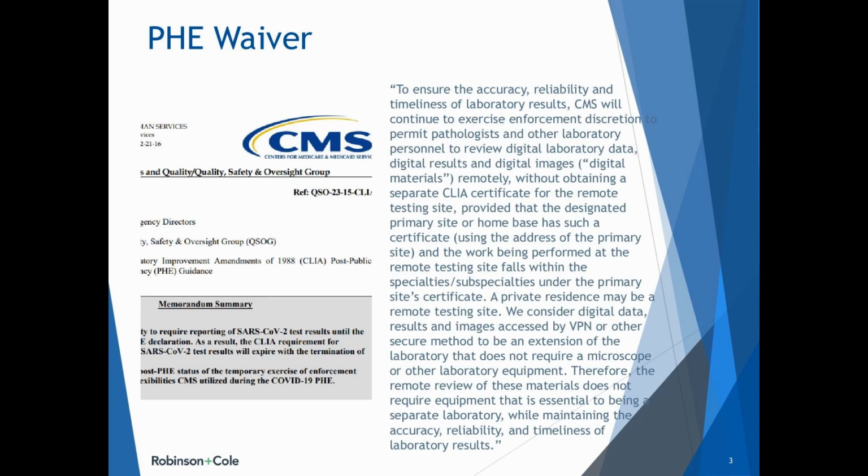And these had some waivers, in light of the discussions and the quality assurance discussions at the CLIAC level too. CMS came out in May of 2023 that allowed for continued enforcement discretion for some aspects. Here, CMS indicated that they would continue to exercise enforcement discretion for pathologists to review digital laboratory data, results, and images remotely without obtaining a separate CLIA certificate for the remote testing site, as long as it falls within certain parameters.